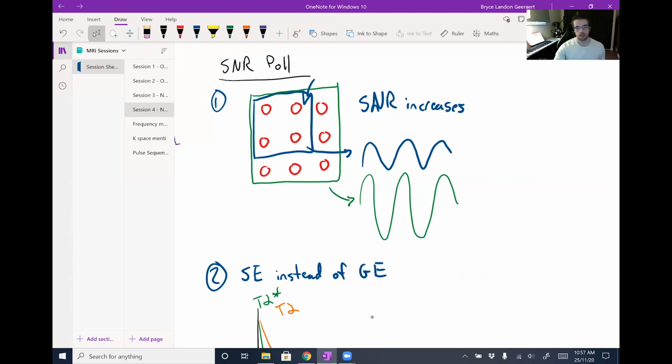Also worth noting that T1 effects are described by an exponential growth, right? So it's very quick at the start and then much slower and more gradual later on as it approaches that 100% magnitude asymptote. So even when the NMV has largely recovered, allowing more time will still allow the NMV to recover, even a little bit. So generally increasing our TR increases our SNR.